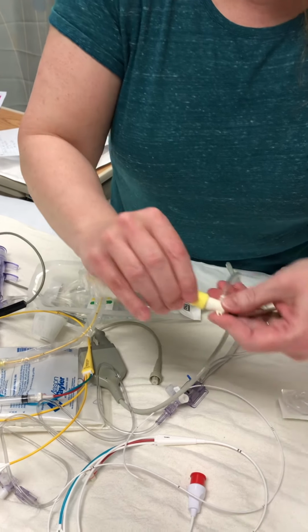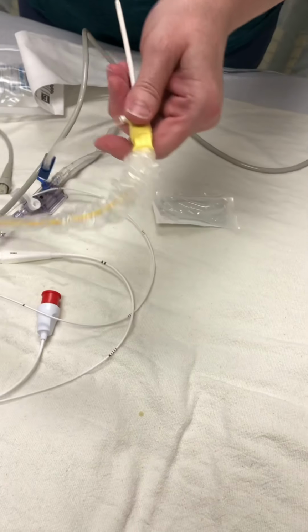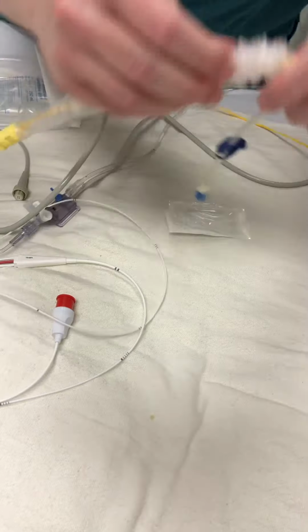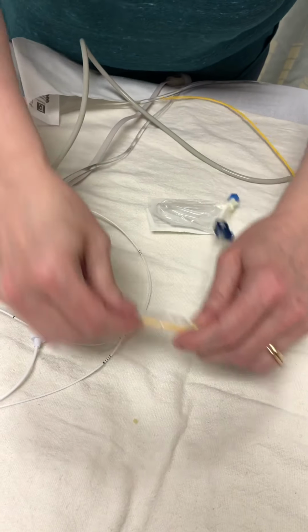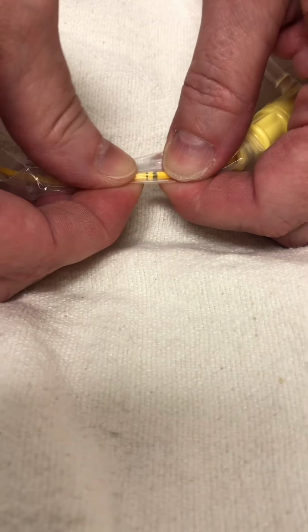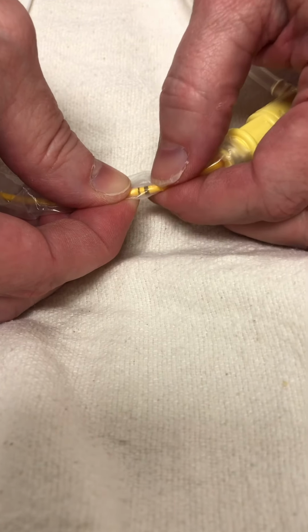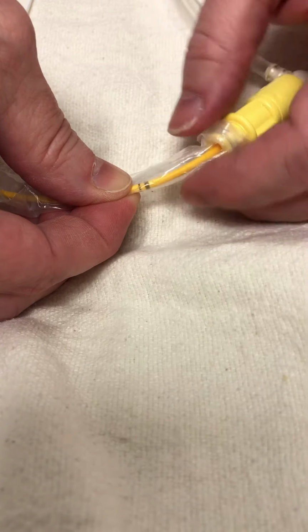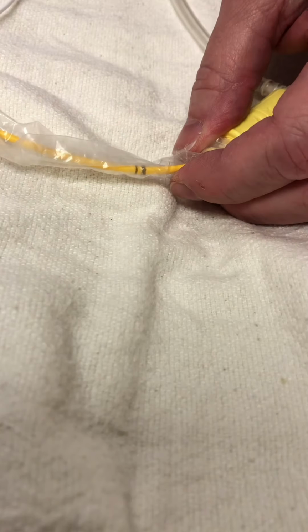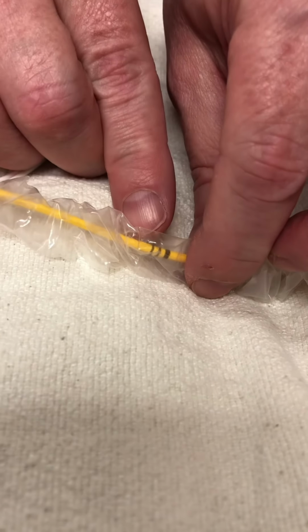Okay, with our Swans, to check and see where they are, we want to see what type of level they're at. If you take a look, the big line is at 50, the little line is at 10. So here, this is 50 plus 10, this is a marking of 60. This is a marking of 50, 60, 70.